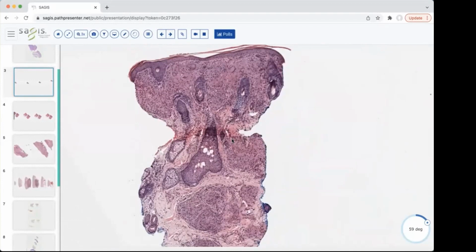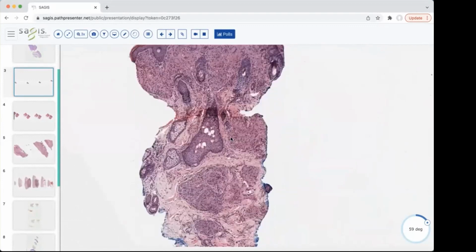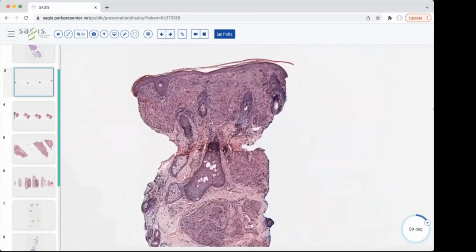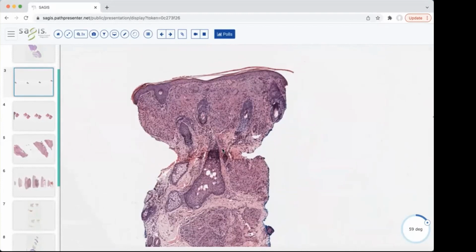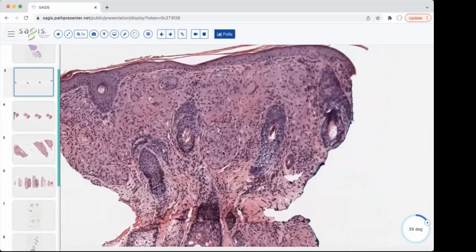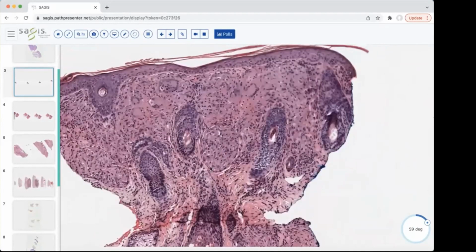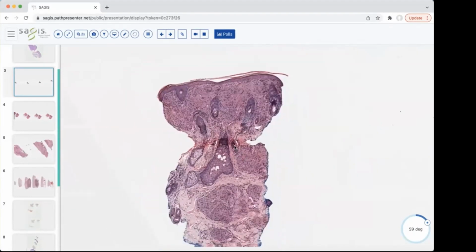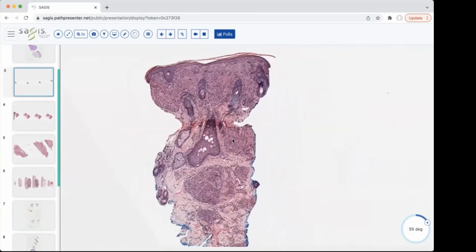But the big things are to rule out infection and to rule out a foreign body. So a dermatopathologist would often polarize the slide just to make sure that there's nothing that comes up easily, although some have described silica within these granulomas in patients who have sarcoidosis. But this is a great example of a sarcoidal granulomatous dermatitis, and I think you can see that at the low power, it truly is the naked granulomas.